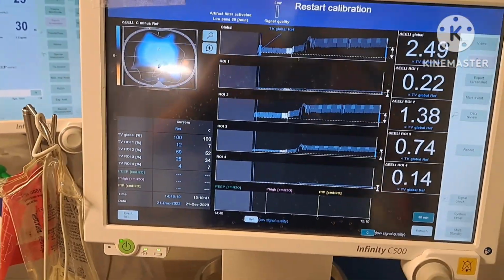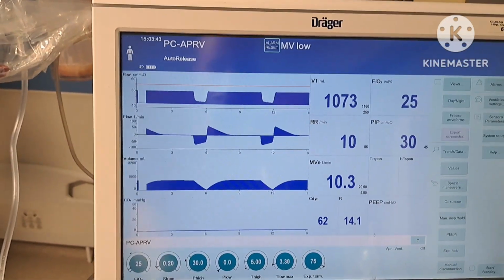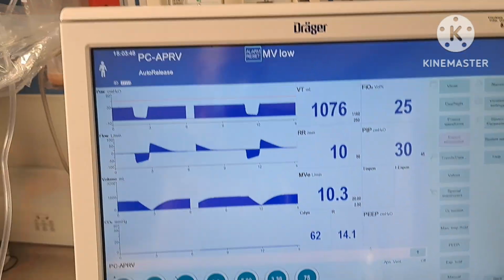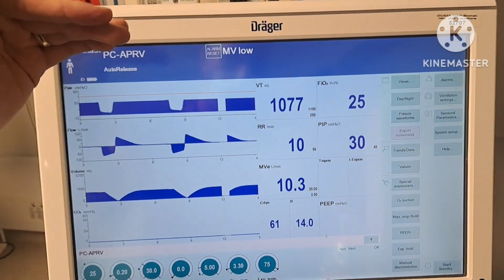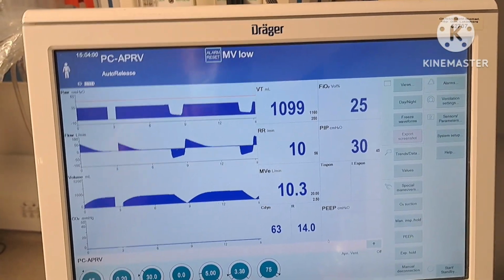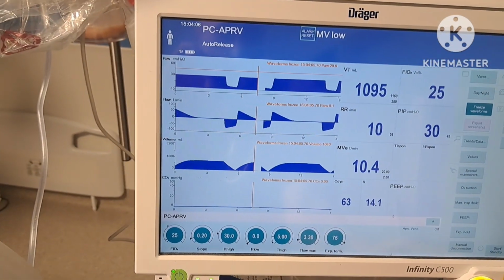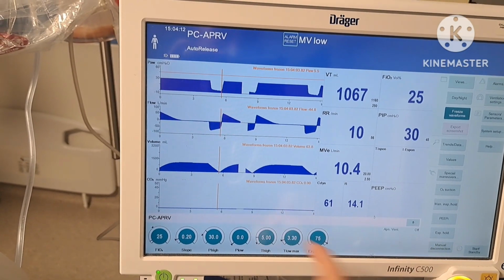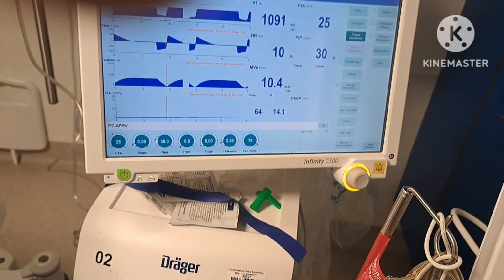So we're recruiting on all levels, and it all depends how fast you want to go. Do we just keep it at 30, aware of this tidal volume here that's really a release? It's not pushing 1 liter into the lung from a peak level. The patient is holding at 30 of pressure for 5 seconds, recruitment's occurring, and a passive release that is very brief, stopping only, see, right here you can see. Notice the release here, look, it stops right there. It doesn't go down to 0. So we're not having these large delta P fluctuations.